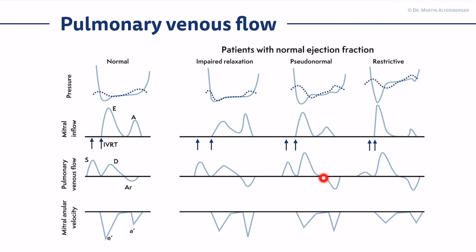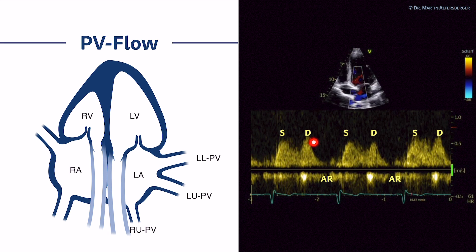The AR wave — atrial reversal — is a good sign. In a young healthy athlete you do not want to see a prominent AR-wave, just a small reversal of flow. In young, healthy, fit individuals, the S-wave can be a little smaller than the D-wave. Furthermore, we have the mitral annular velocities — the E-prime measurements, and the corresponding A-prime. We look at the E-prime mostly. The lower the E-prime, and the higher the E-to-E-prime ratio in restrictive filling pattern, the more it shows elevation of filling pressures.